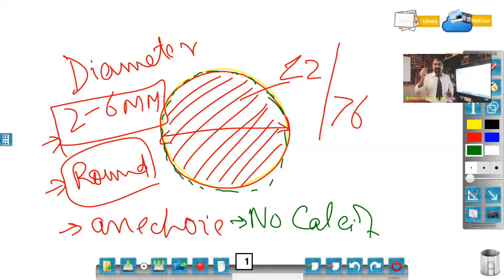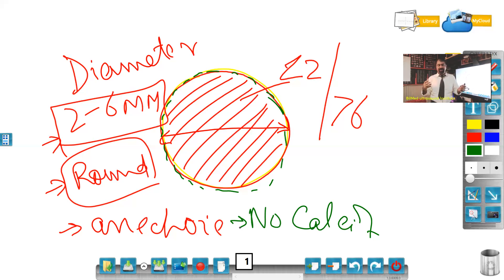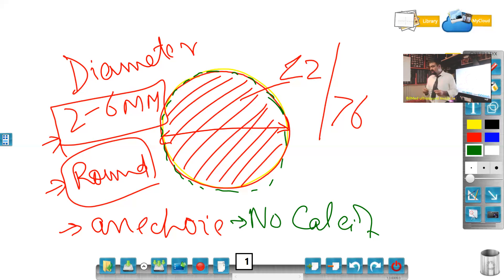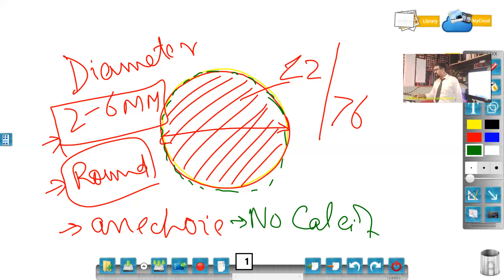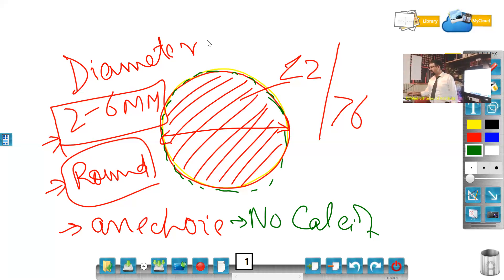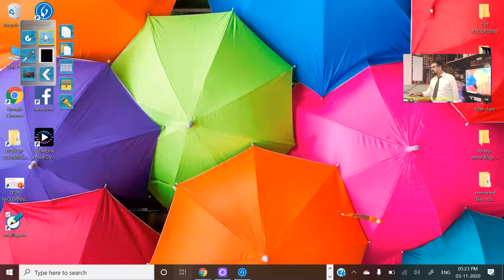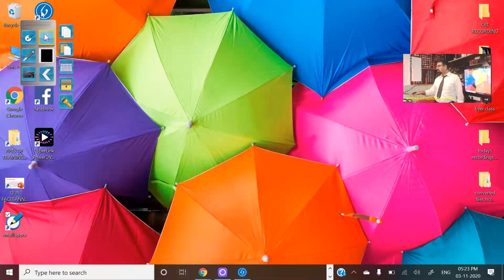So what is abnormal? Less than two, greater than six. Don't get happy with a big yolk sac — don't think that this pregnancy will land in a healthy one. That is also abnormal. Not more than six and not less than two millimeters is the normal range. And as already said, the shape has to be round — round and round only.